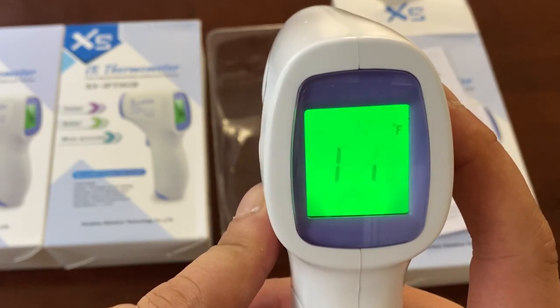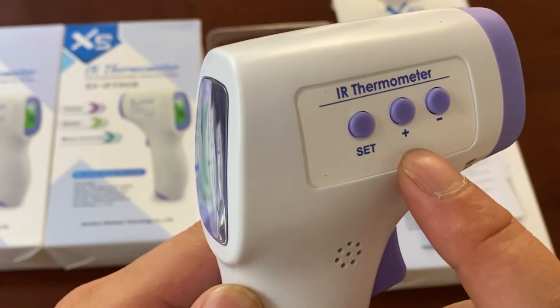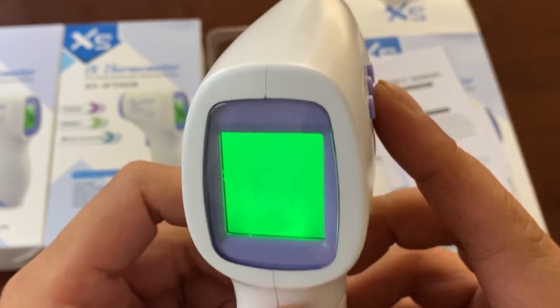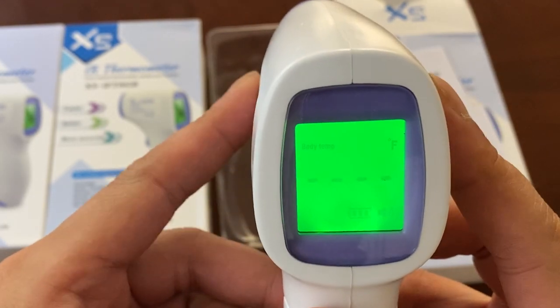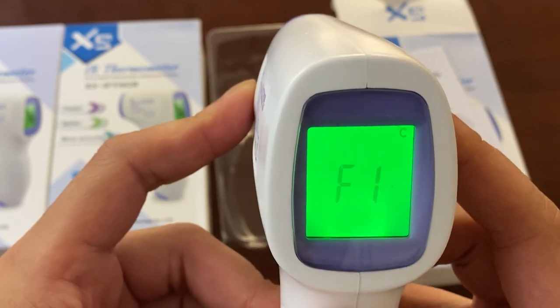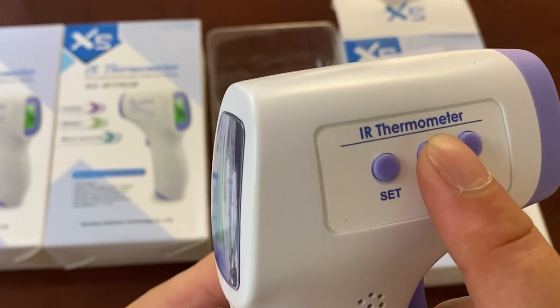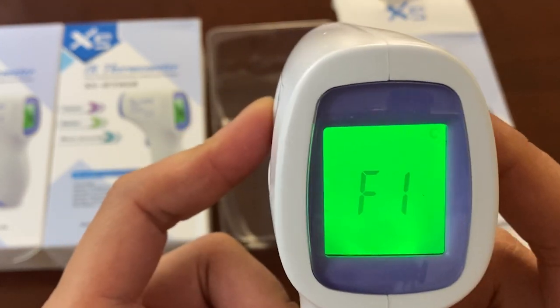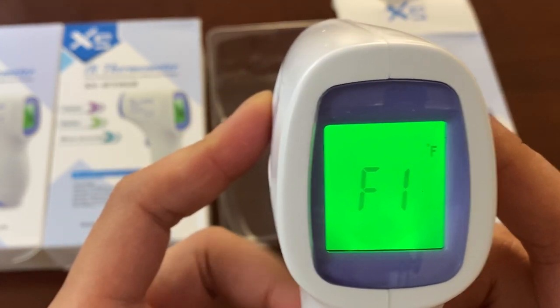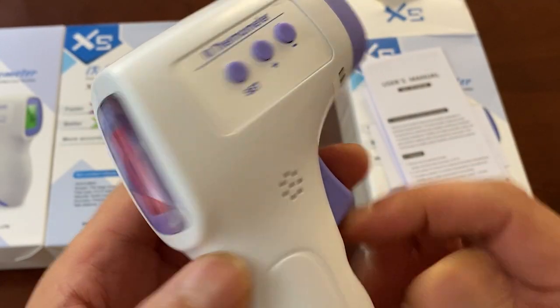Once you see that, you can press this button — the center one with the plus symbol. Let's turn it on again. Set it. Once you press it, it changes between Celsius and Fahrenheit. Then you just hit the trigger again and you're all set.